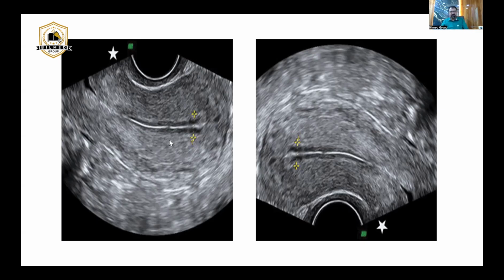So the hemangiomas are hyperechoic, and many doctors think that it is a bunch of capillaries, a bunch of vessels, and they are expecting the color Doppler to pick up color. It is not picking color.